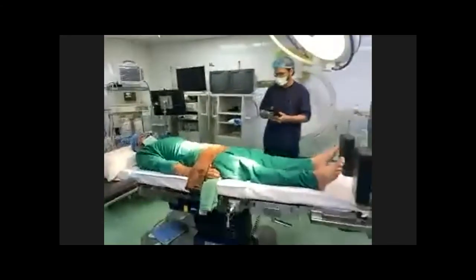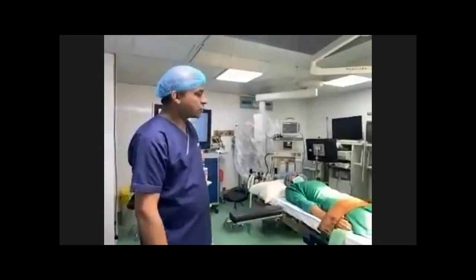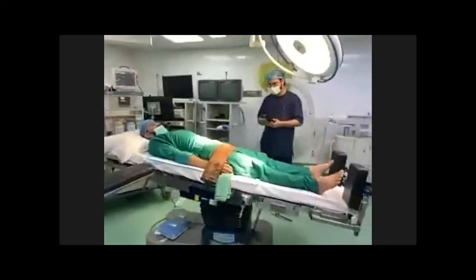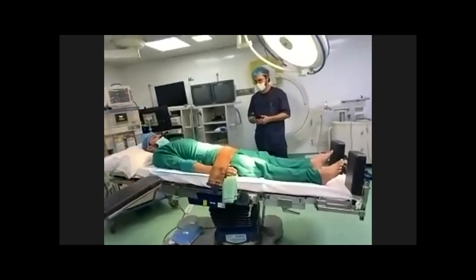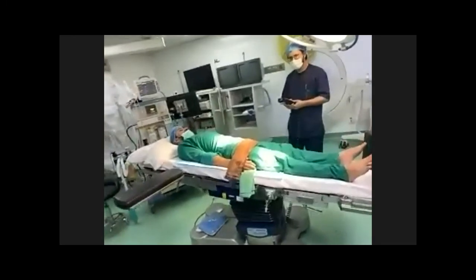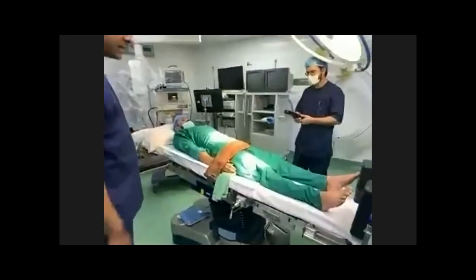The other position we are going to narrate is the reverse Trendelenburg position, head up. This position is usually used in laparoscopic cholecystectomy and laparoscopic bariatric procedures. You can do a right up as well, and head up with right up is usually used in laparoscopic cholecystectomy procedures. Then you can again flatten the bed.